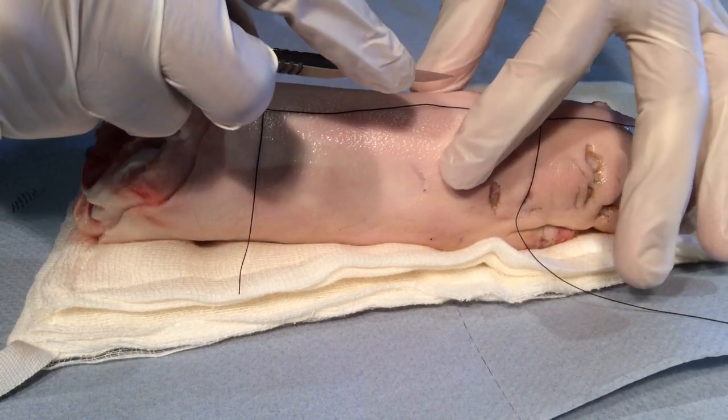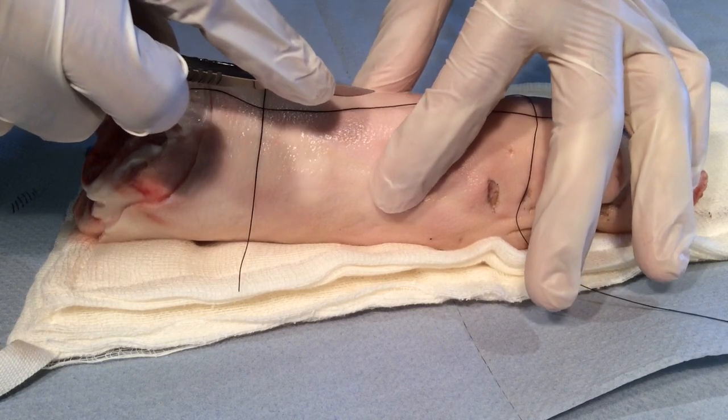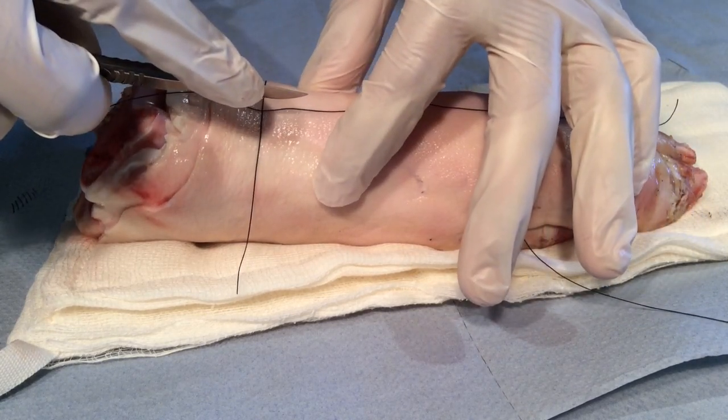When you are applying traction and counter-traction, you must not apply pressure in front of the scalpel incision.